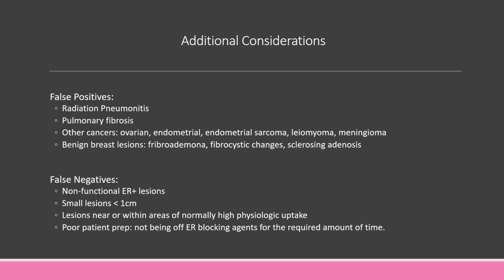And then false negatives can actually occur also if there are non-functional estrogen receptor lesions, small lesions that are less than 1 centimeter, lesions near or within areas of normally high physiologic uptake, such as the hepatobiliary tract, the bowel, or even the uterus, and then poor patient prep, not being off the estrogen receptor blocking agents for the required amount of time, could lead to a false negative study.